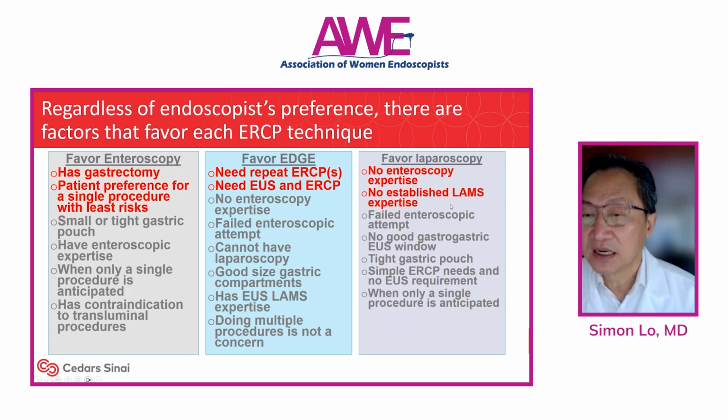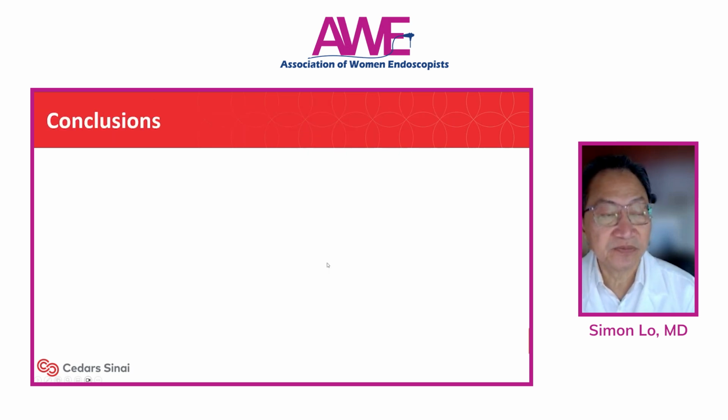Likewise, in a community setting where there's no expertise in doing enteroscopy or to perform a more invasive procedure, then laparoscopy is the best choice in doing these cases.